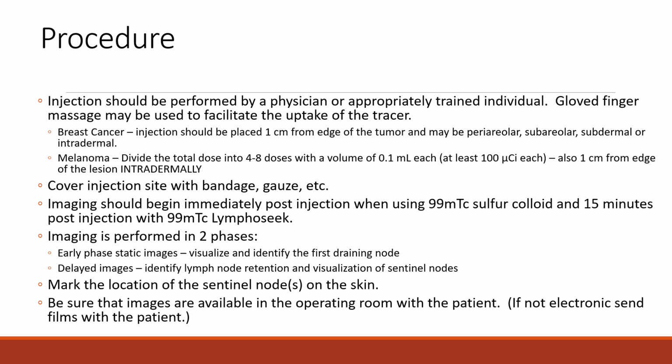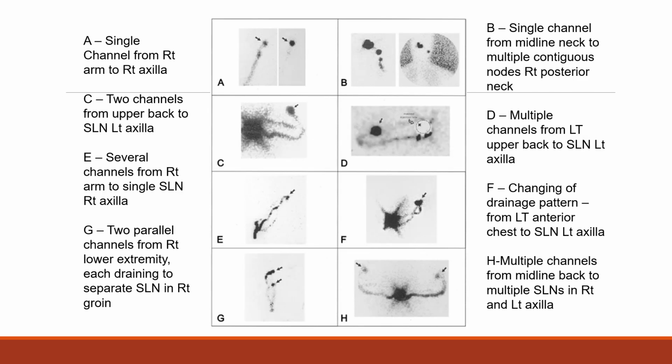I like taking images. I think that's best for the patient. Some people don't because they're lazy and it's easier not to. And some doctors don't look at them because they just use the intraoperative probe in surgery, which is great. It's great that you have one, but if you don't know where to look, you might miss something. So that's my soapbox on that.